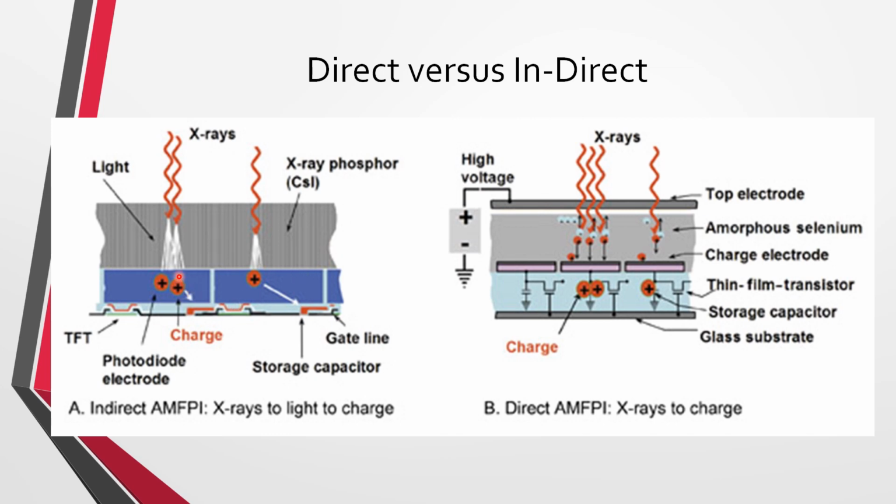Then there's the coupling element in here, which is directing the light, and then there's the collection element down here, which is collecting the charges, okay, and each one of these right here could be considered a del, okay, and it would be on a matrix, and there'll be millions of these throughout the detector.